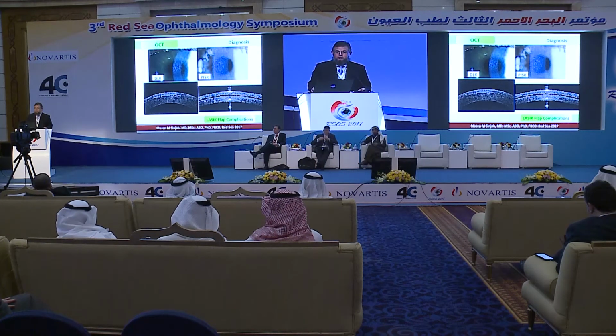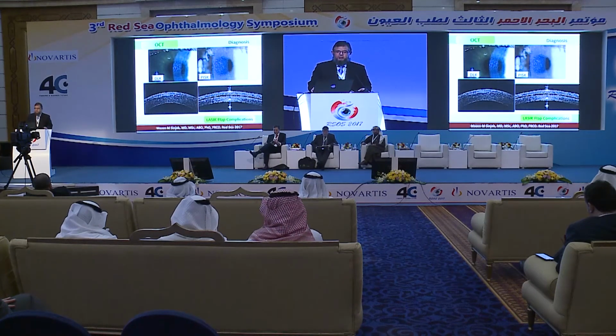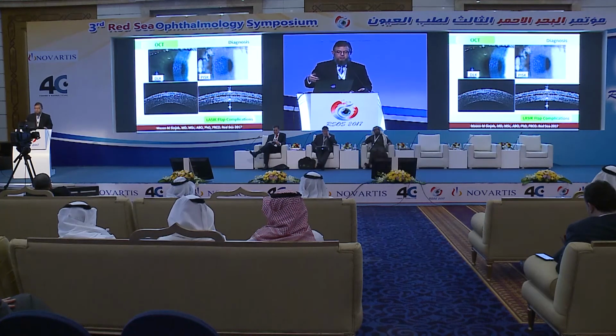the doctor will start steroids, increasing the steroids, and it worsens with steroids because it elevates the intraocular pressure, and the intraocular pressure will increase the fluids within the stroma and under the flap, and this will lead to a spongy structure of the cornea and will lead to false low IOP measurements, and this will increase the problem more and more. Doing OCT will solve the problem, as you see.